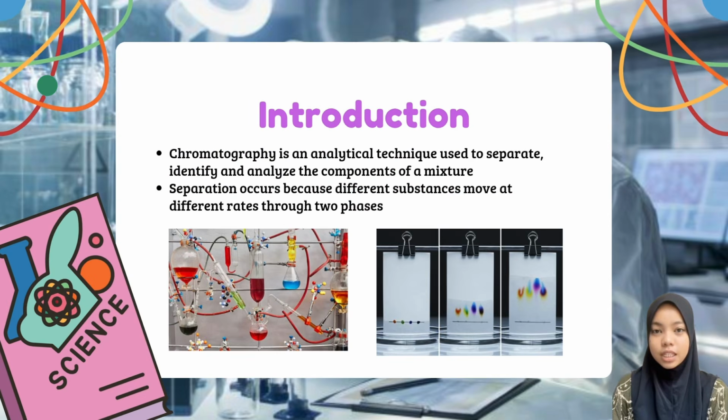Chromatography is an analytical technique used to separate, identify, and analyze the components of a mixture. It works by separating substances based on how they interact with two different phases. Because different substances travel at different speeds, they can be separated and identified individually.